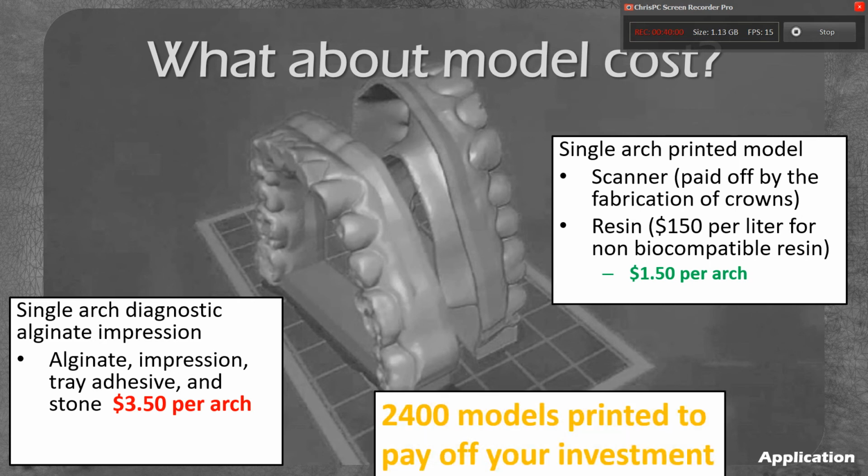So if you're only using it to replace alginate impressions, you're going to have to get about 2,400 models to pay off your investment. Now, that being said, if you're using these models for digital smile design and digital mock-ups on patients, well, then that payoff might come a little bit faster.